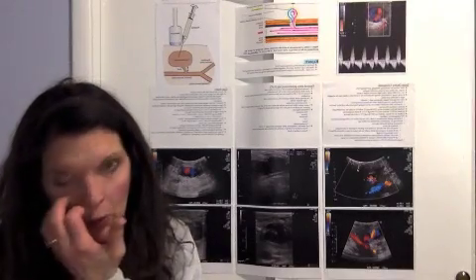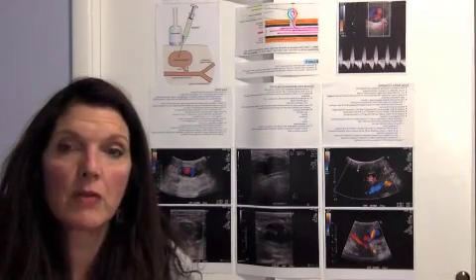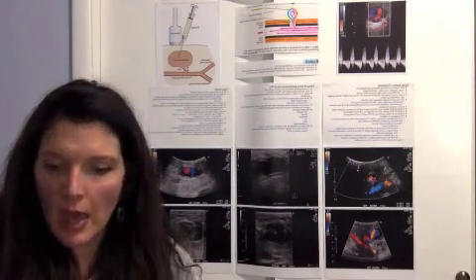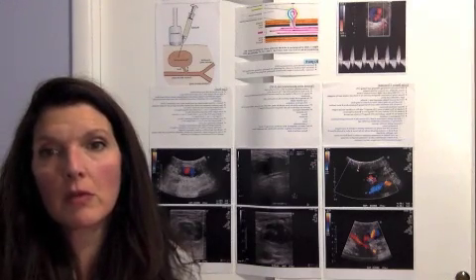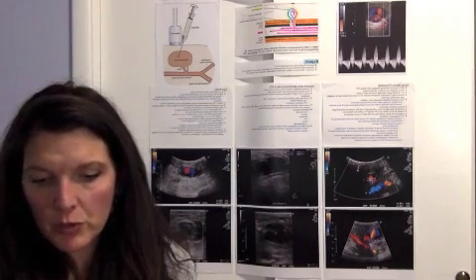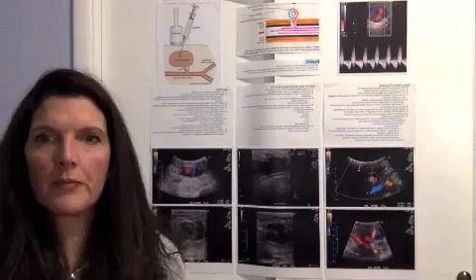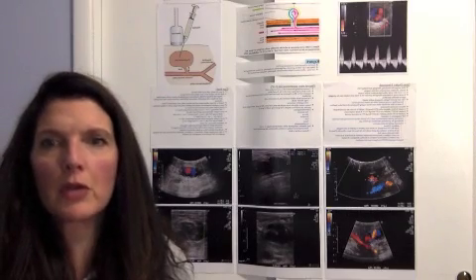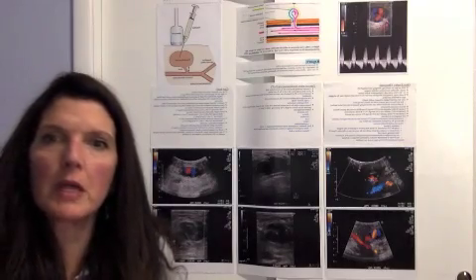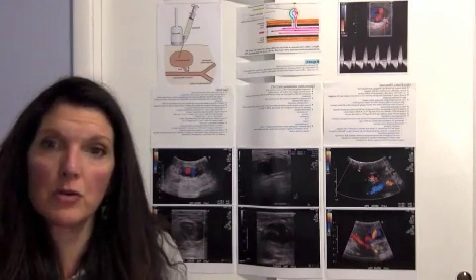In addition, you want to evaluate the parallel veins to see if there's any thrombus, and that you can do in B mode with compressions, and also evaluate the vein with color and spectral for flow to rule out arterial venous fistulas. For the management of pseudoaneurysms, ultrasound is used to monitor for spontaneous thrombosis and or to see if the pseudoaneurysm is growing.